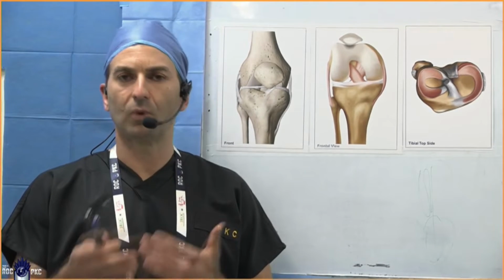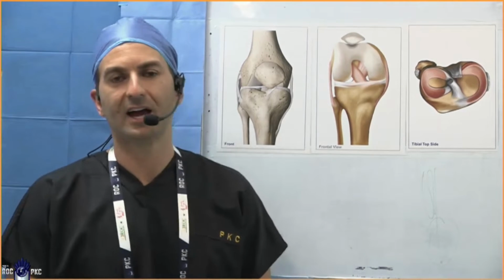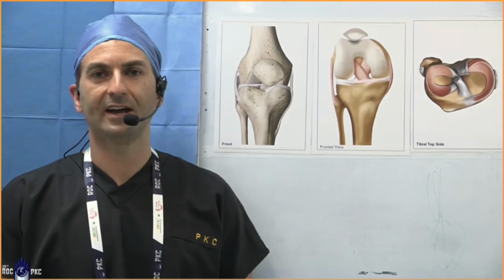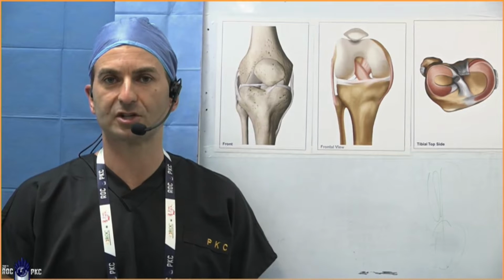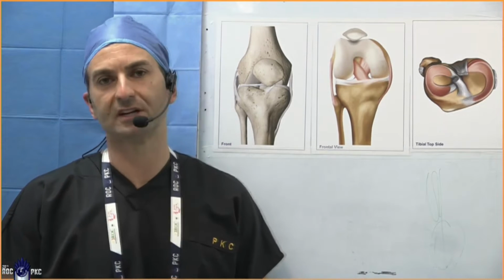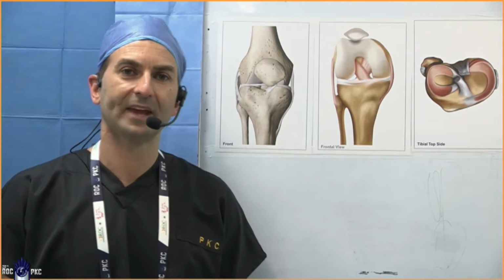Whether I take 1 or 2 tendons will really depend on tendon size. We've just finished a randomised controlled trial looking at the differences in donor site, and there is a significant difference when we take 2 versus 1. So a single tendon reconstruction is my preference, but if it's insufficient to achieve a size 8 graft, then we'll take a gracilis as well.